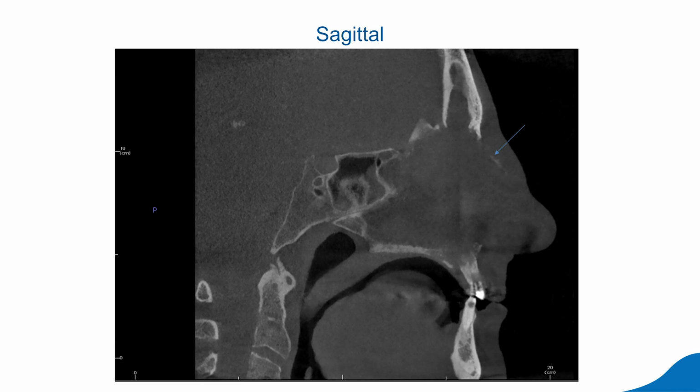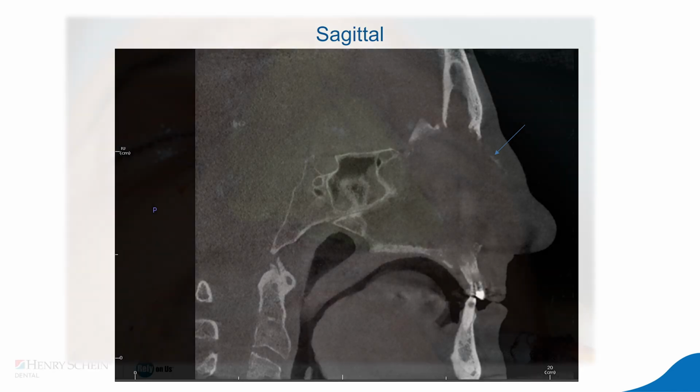So that's why you saw that a large resection was made, the whole nose basically, and that was a very long surgery with 4 teams, and the patient stayed for like 18 hours in the OR. So those are very aggressive cancers. And squamous cell carcinoma is the most prevalent head and neck cancer. So it is something that you have to look at very carefully on the pan. It was not that easy to see. And on the scan, you have to look at the whole thing and assess all of the structures.